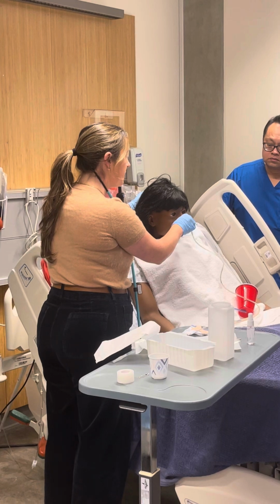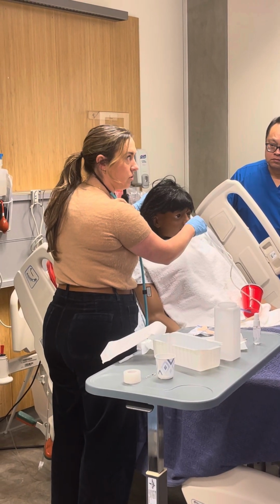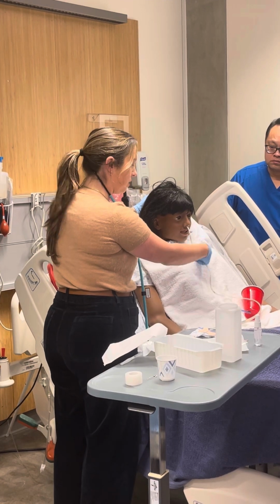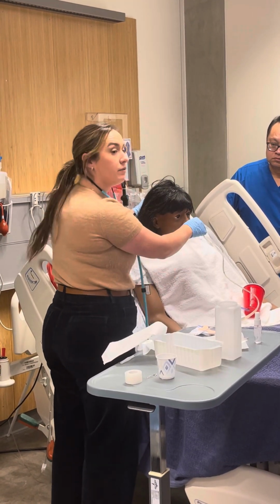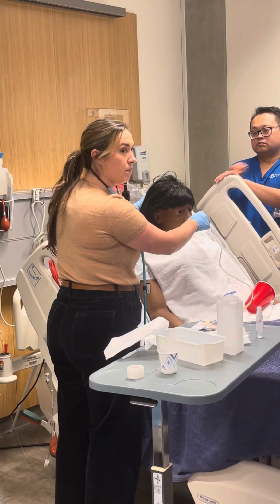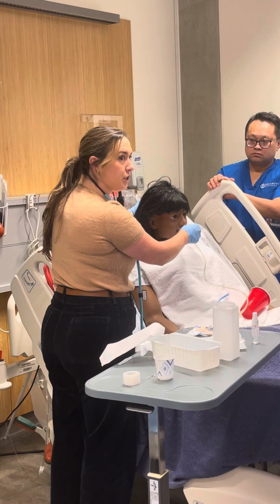On these mannequins, actually most of them, you can only go to about 35, 40 because they have a little pouch there. So in your videos, you're going to say, the mannequin is going to stop me from going all the way, but I would go to where I measured at 60.